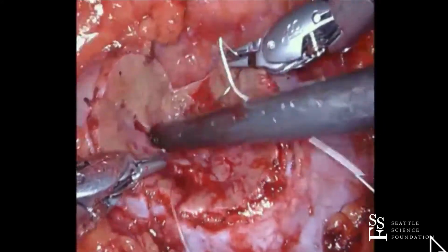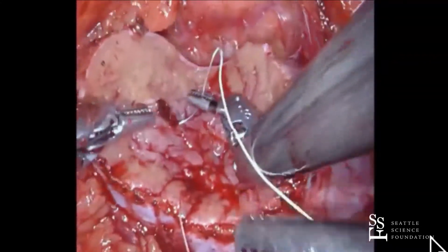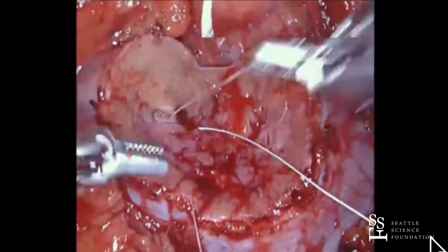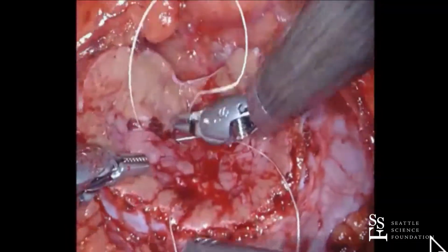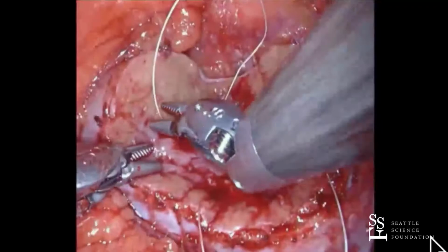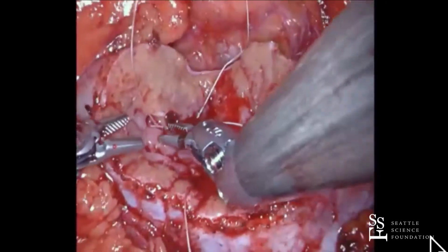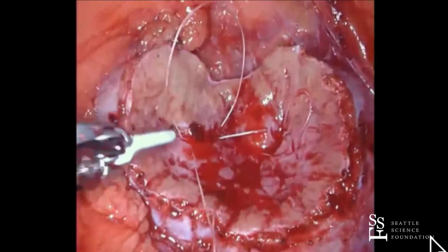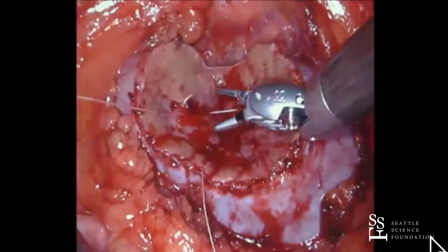And there's one I cauterized right there, so I'm going to go get that. But if you think of this defect as like an oval in the middle, you basically are running on each side of the oval. I think Ronnie makes that point clear in his talks. And that's kind of what I do with these sutures as well.